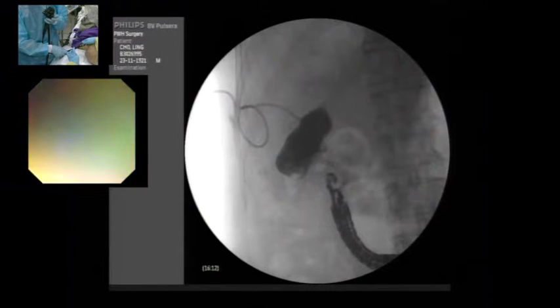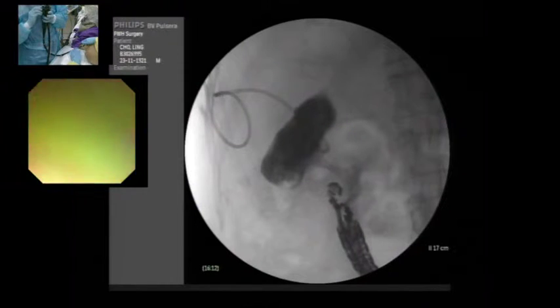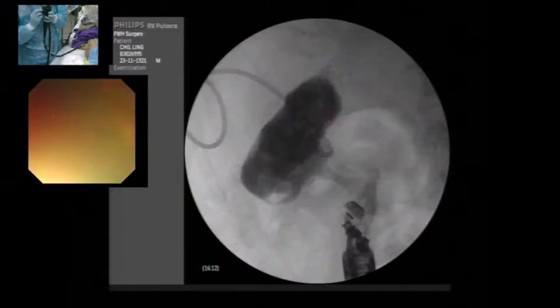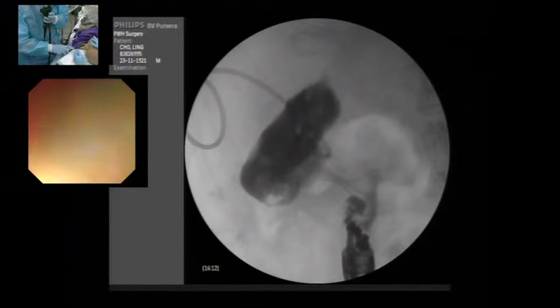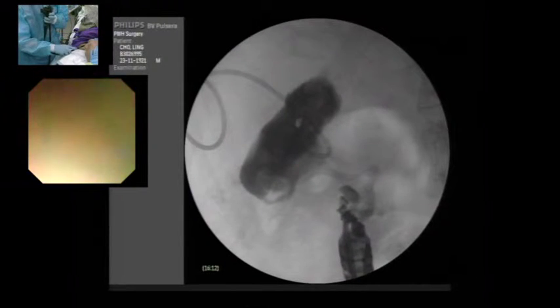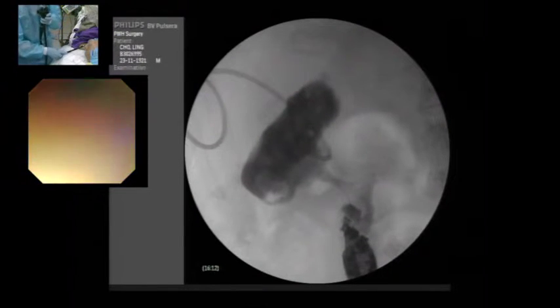Can I have a magnifying view of the fluoroscopy? See the position of the stent. Ah, yes, that would be great. Can you magnify up? There you go. Magnify more. One more. So I think all the contrast is coming out. Okay, good. From the gallbladder. So you can see the center of the stent is still not fully open. Yes, that does need to be dilated up.